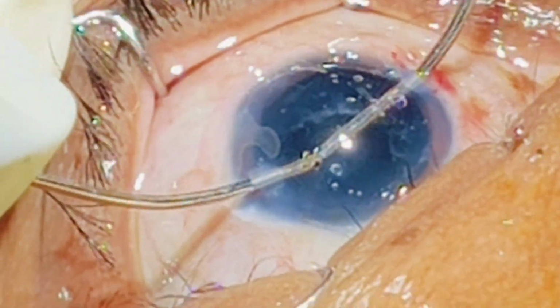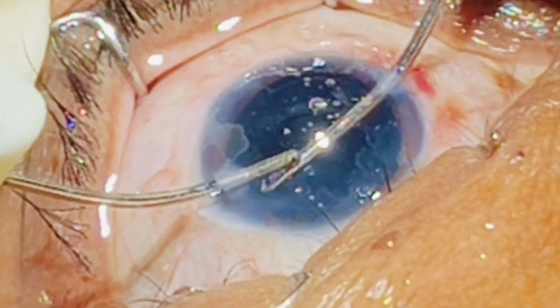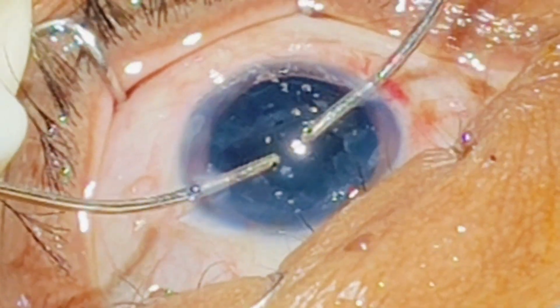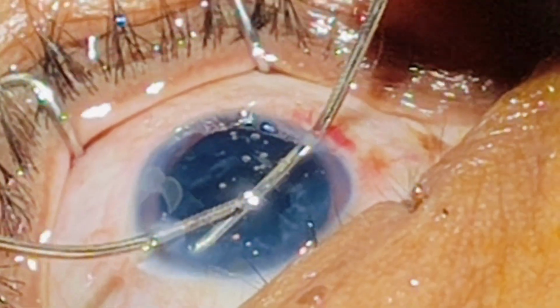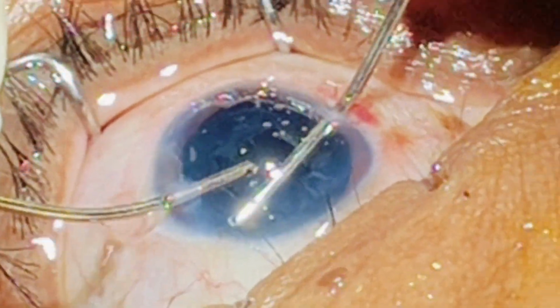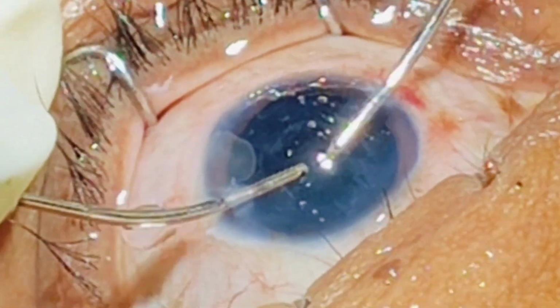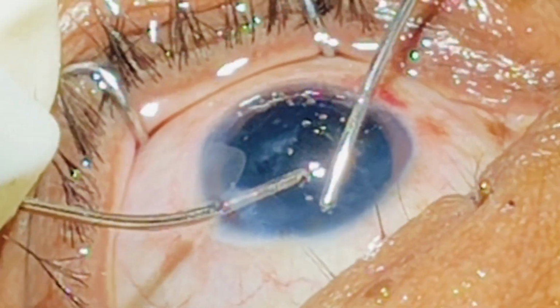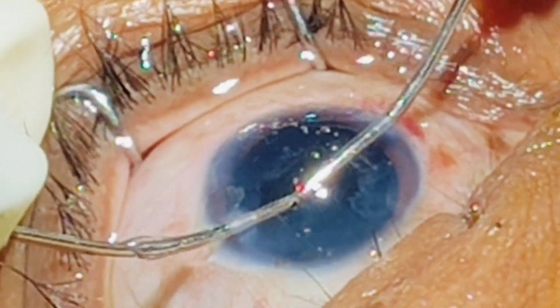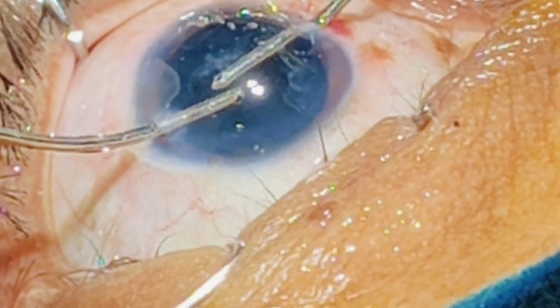So now we'll go for bimanual irrigation and aspiration. Never ever drag the cortex, always catch hold of the cortex at the junction, then do swiping movements. See how swiping movements, then bring it to the center and aspirate. Never ever just drag, no, swiping movements like this, so that it gets smoothly pulled away from the attachment.